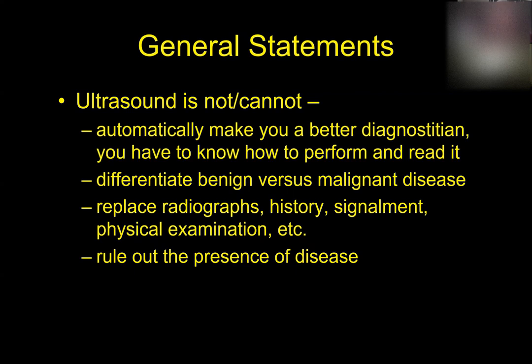On the other hand, one day you'll walk in after doing a bunch of attempts at ultrasounds and practice, and one day it'll just click, just like snow skiing does. One day, suddenly, for whatever reason, now you can do it, and then you can just get better at it. So I find learning ultrasound is kind of the same way.